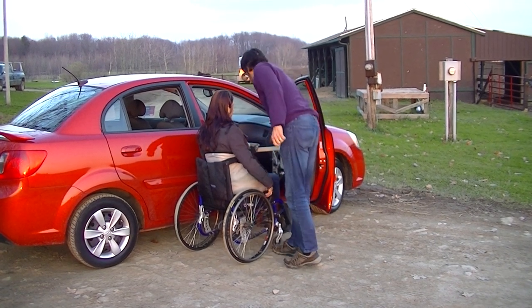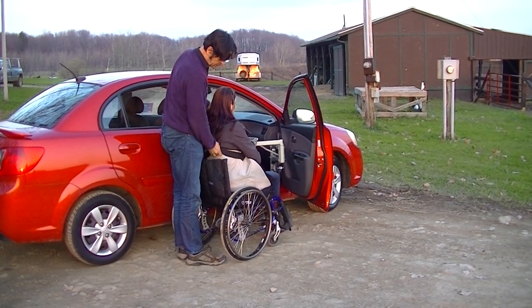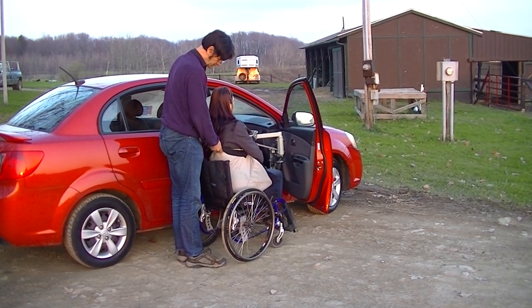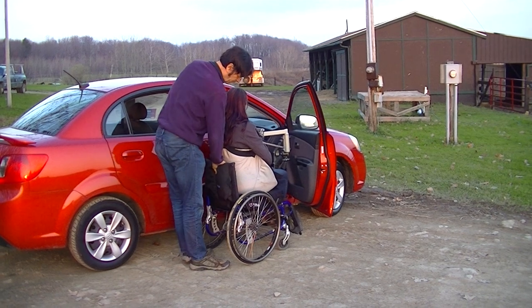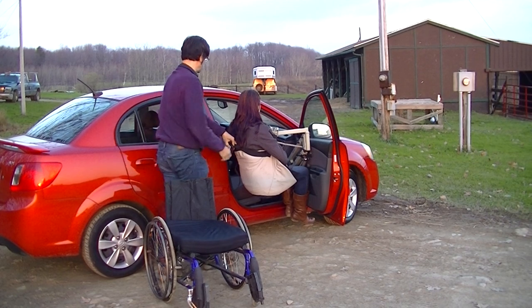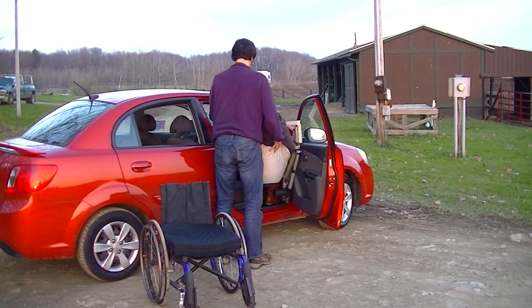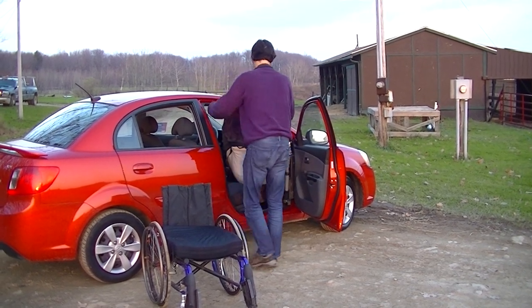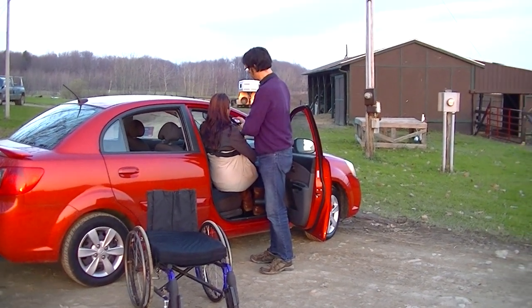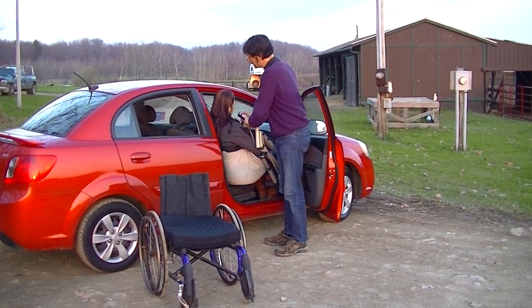Once we're connected, grab the power pendant. Once we're up and off the wheelchair, move the chair out of the way. We'll guide the user straight into the vehicle, going right over to this position so that the head is right next to the roof line.